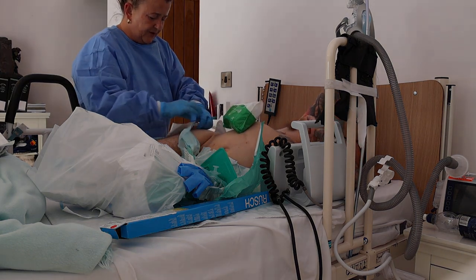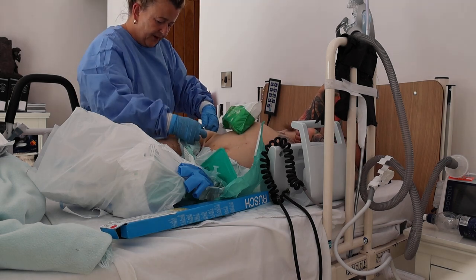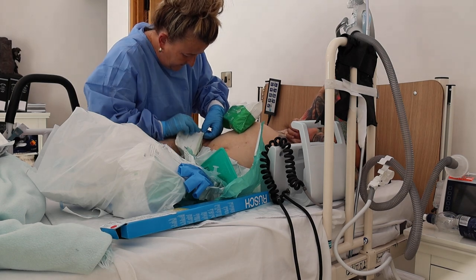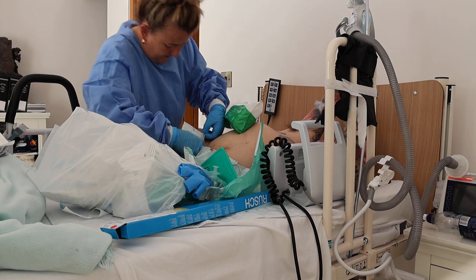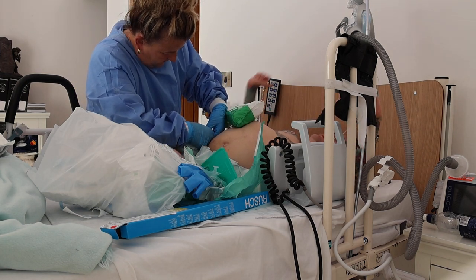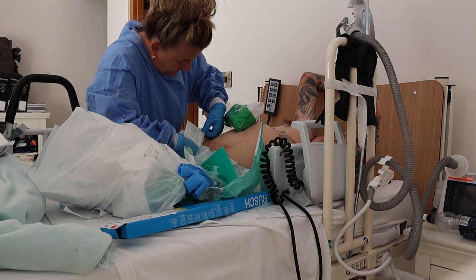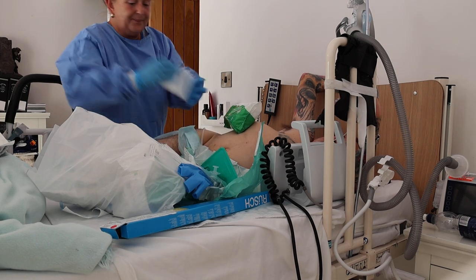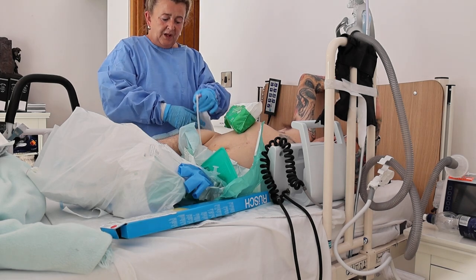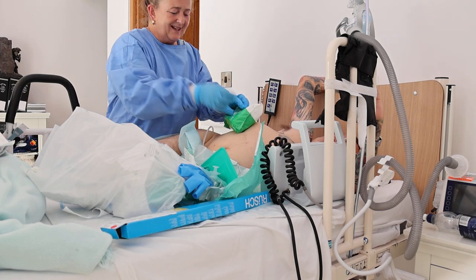So here we go, look. From the nozzle, I'm going to do it just from here now, because it's easier. There's my first reading. That's my first reading of 14. It used to be 28, but this is a new one. It's still 28. You take it right to the port, on both, and check that down there, and you know your catheter is in situ.